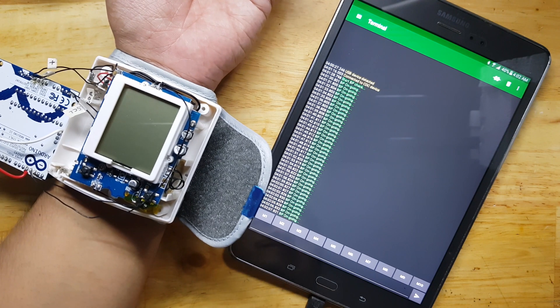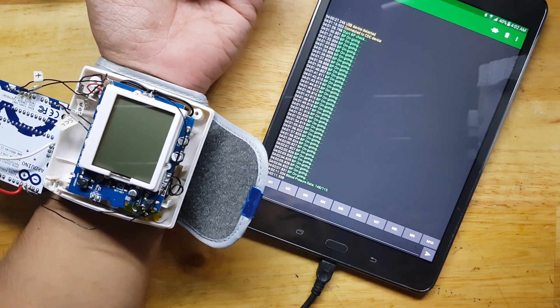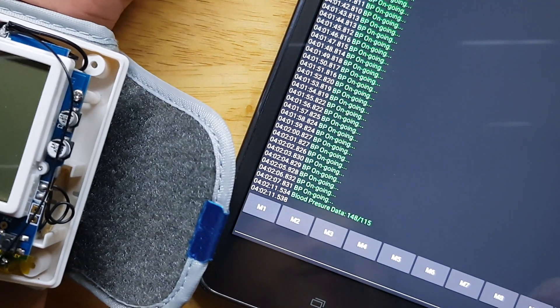148 over 115. There you go, it's 148 over 115.